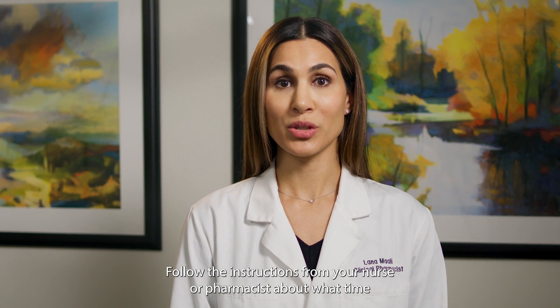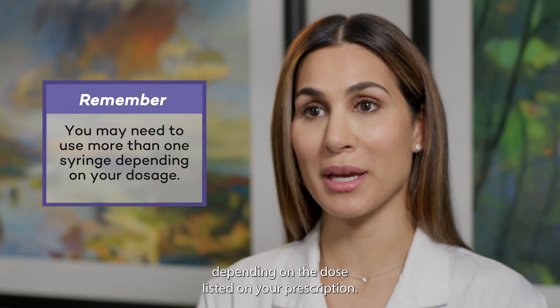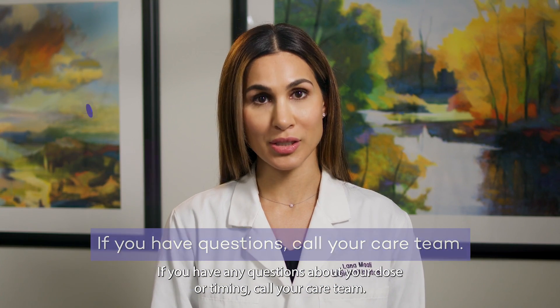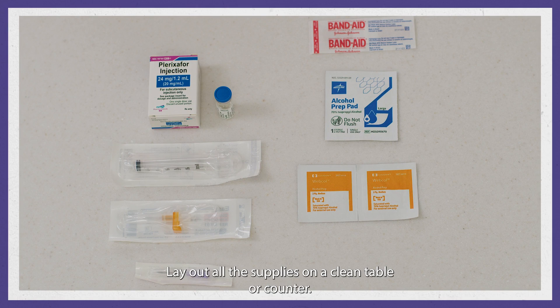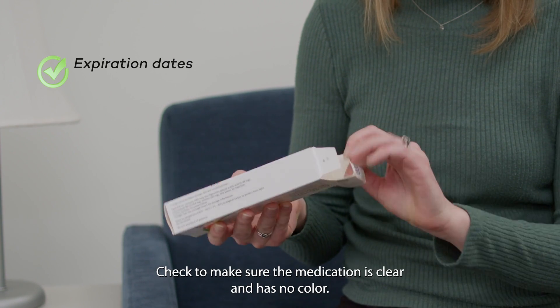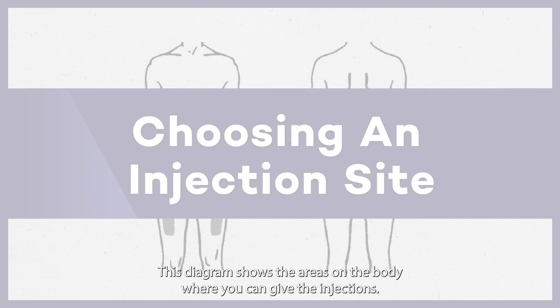Follow the instructions from your nurse or pharmacist about what time you need to give the injections and the exact dose you need to inject. You may need to use more than one syringe depending on the dose listed on your prescription. If you have any questions about your dose or timing, call your care team. 30 to 60 minutes before you plan to give the injections, take the medication you will need for that day's dose out of the refrigerator. Before you give the injection, lay out all the supplies on a clean table or counter. Check the expiration dates on all supplies. Check to make sure the medication is clear and has no color. Contact your care team if the medication is expired, discolored, or cloudy.